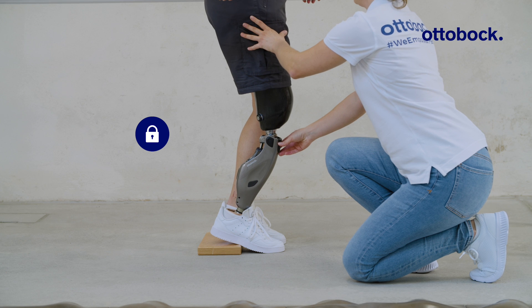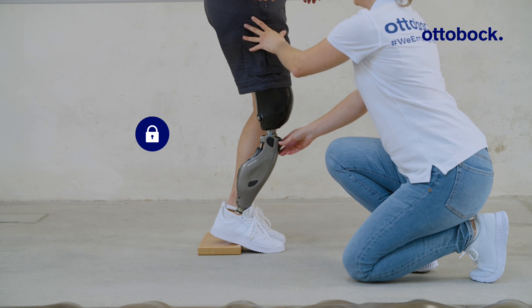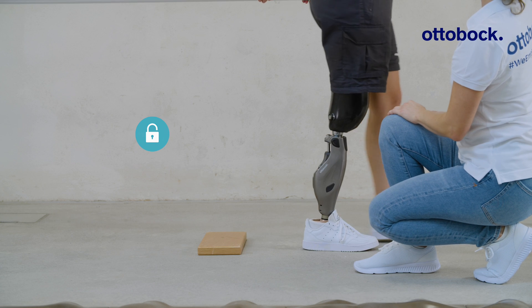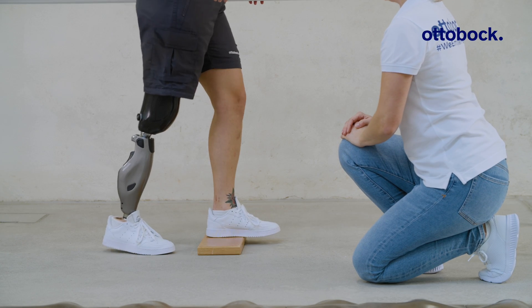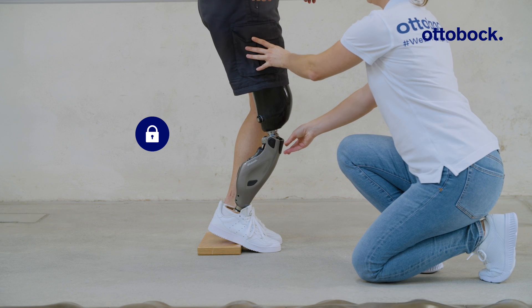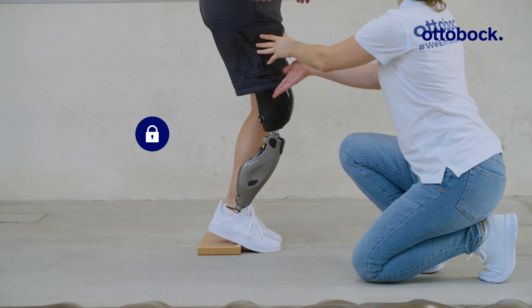Deactivation through unloading of the prosthesis, and deactivation through knee extension.